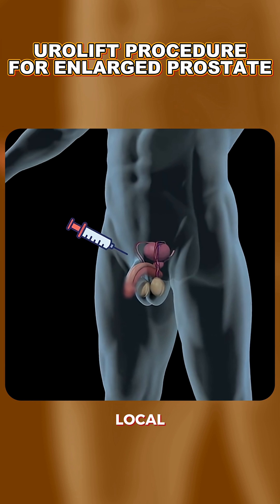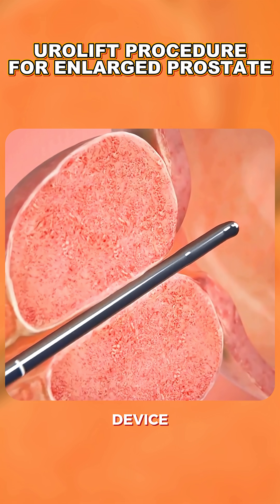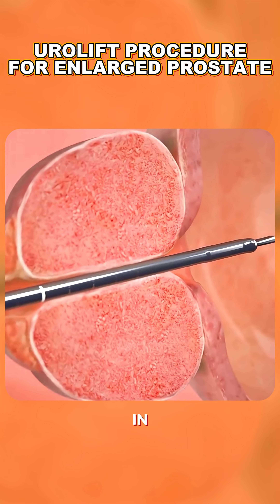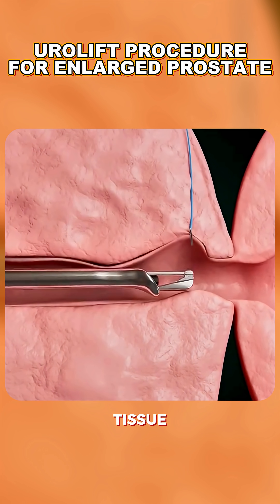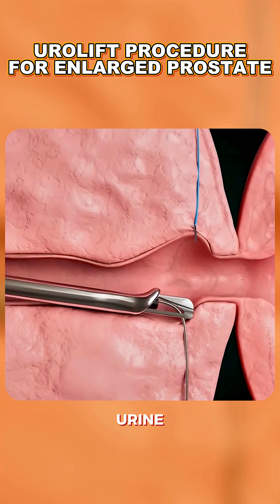It starts with giving local or light anesthesia to keep the patient comfortable. A special device is inserted through the urethra to reach the prostate. Once in place, the Urolift system delivers tiny implants that lift and hold the enlarged prostate tissue away from the urethra, creating a wider channel for urine to flow easily.